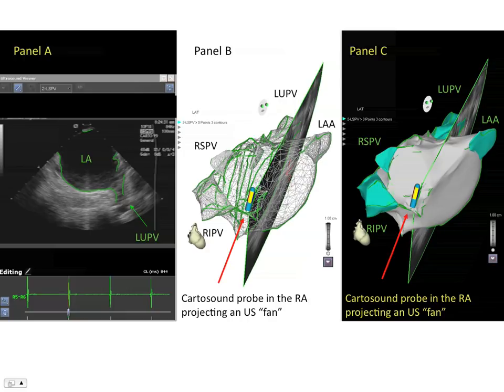The middle panel shows a number of contours traced on gated images displayed in three-dimensional space. One can also see the CartoSound probe projected in the right atrium. Panel C then shows a filled 3D reconstruction showing the body of the left atrium, pulmonary veins, and the left atrial appendage.